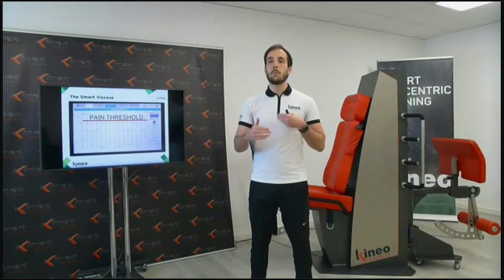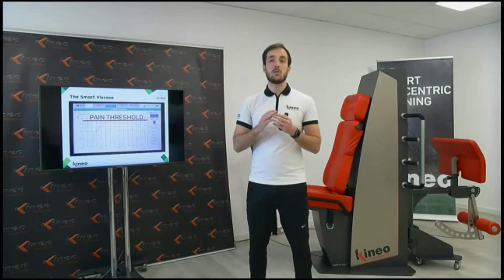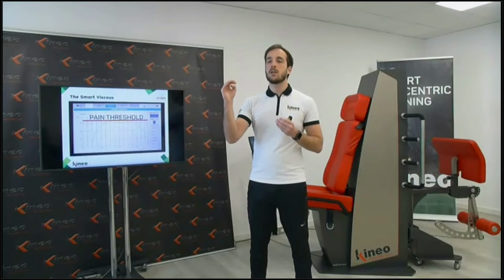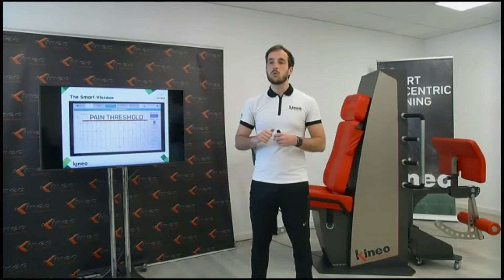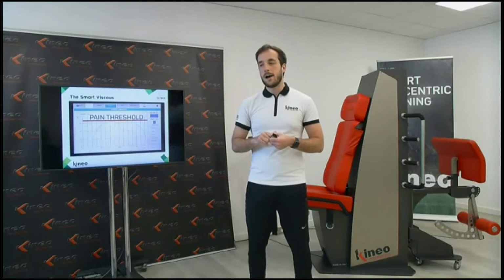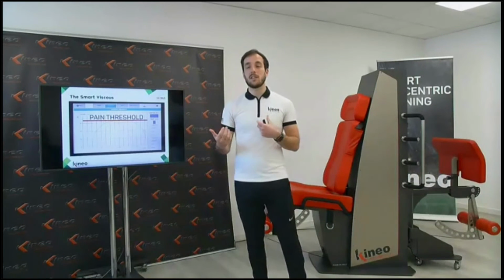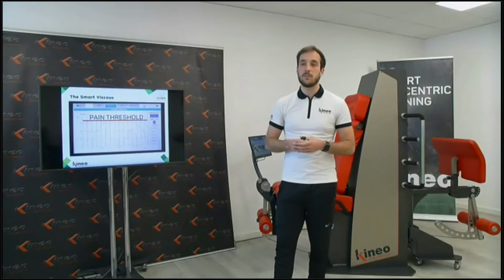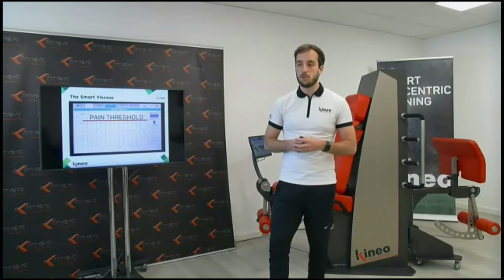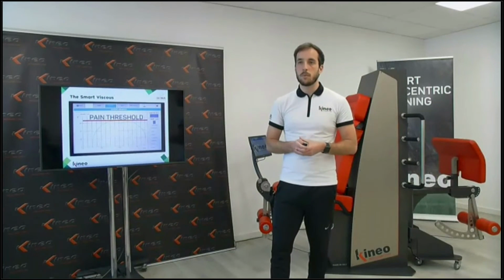So let's try to build up the load, let's try to have a smooth execution, but don't feel pain. Don't put yourself in a condition to harm yourself again and to injure yourself again. And in this way, our job is definitely easier in some way, because the machine is adapting the load automatically, and the patient feels great having the optimal loading at each kind of movement that we are proposing here.